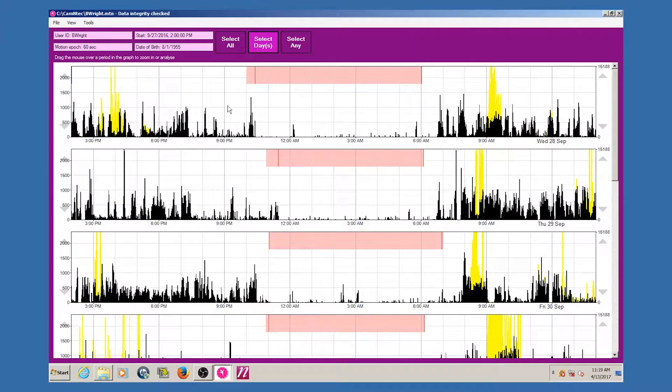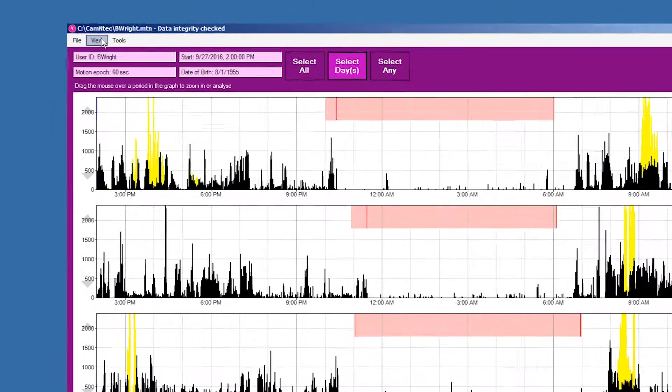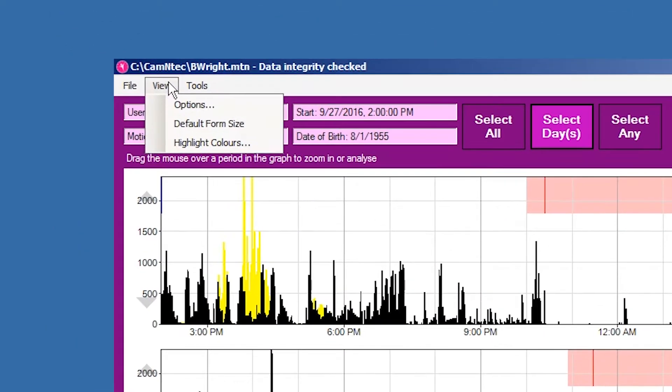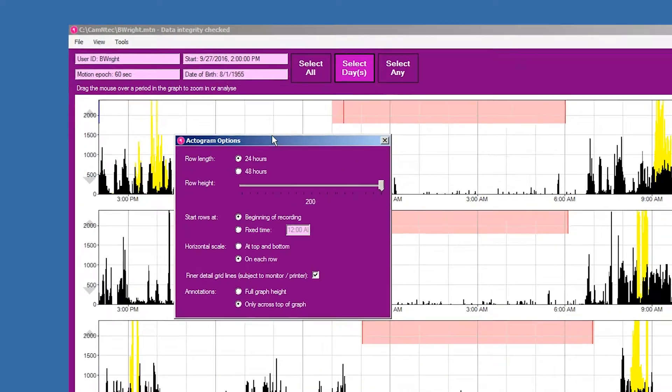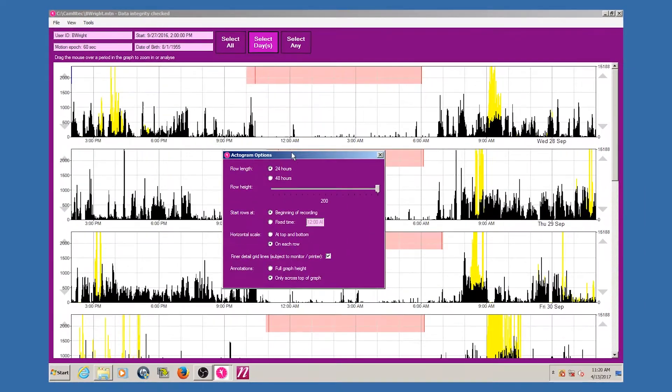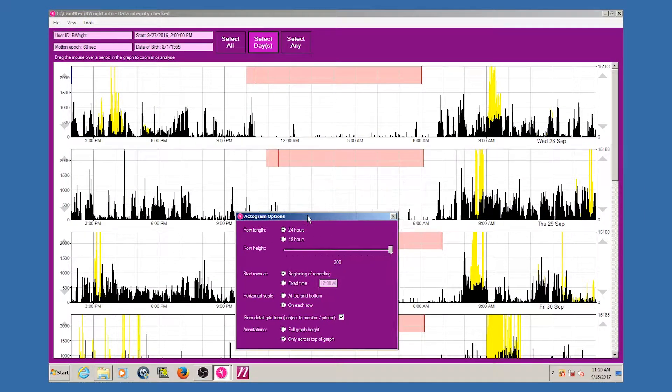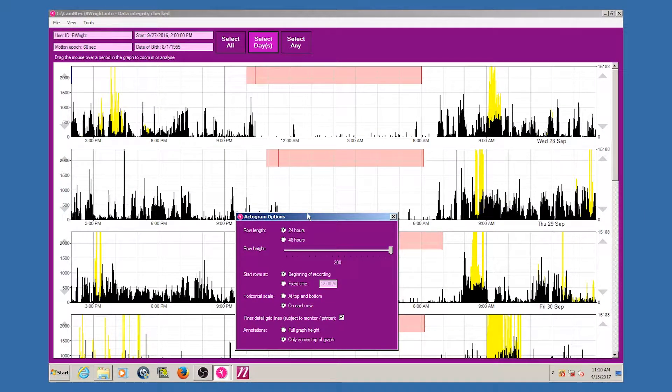The actogram view can be adjusted for different purposes. This is found under the options item in the view drop-down menu. The actogram will adjust to give you immediate feedback after you have changed any of the options.